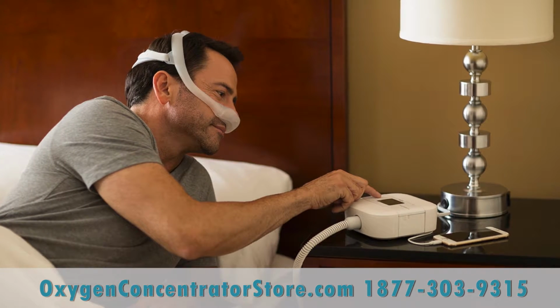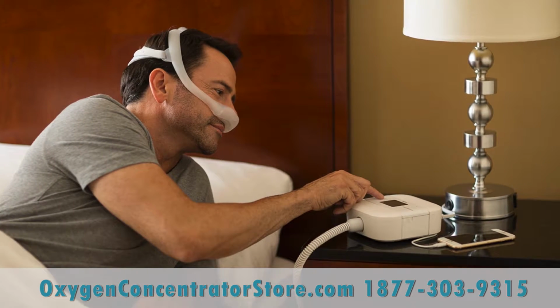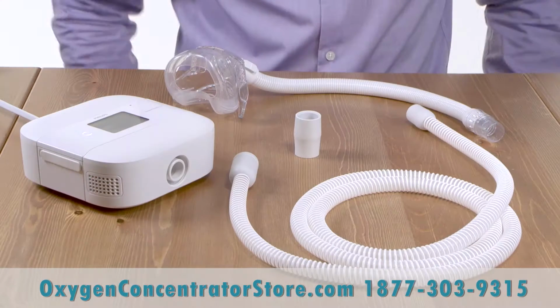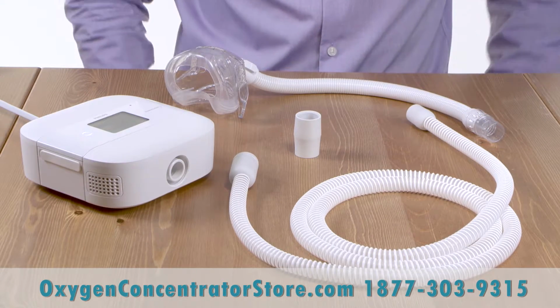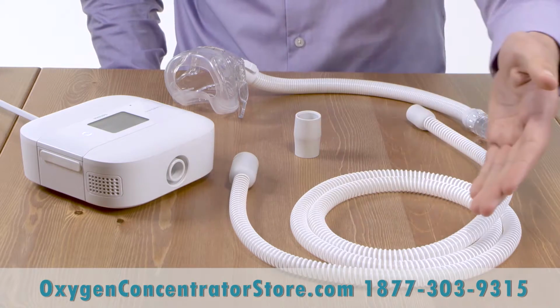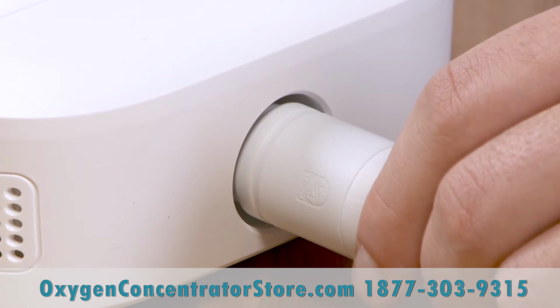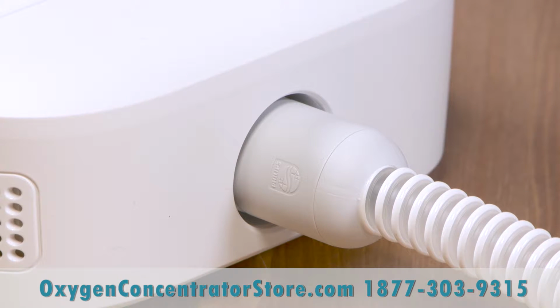DreamStation Go delivers positive air pressure therapy through a breathing circuit comprised of a mask and flexible tubing. The default tubing for the DreamStation Go is the 6-foot micro-flexible 12mm tubing. Connect the 12mm tubing by clicking it into the outlet port on the front of the device.